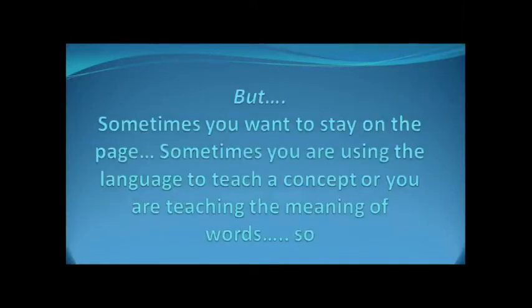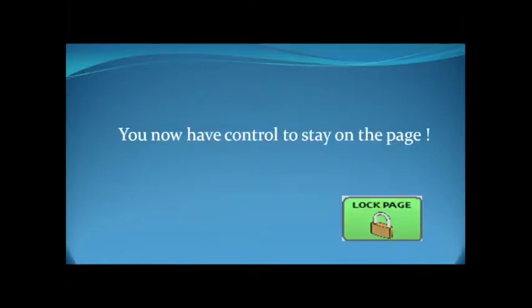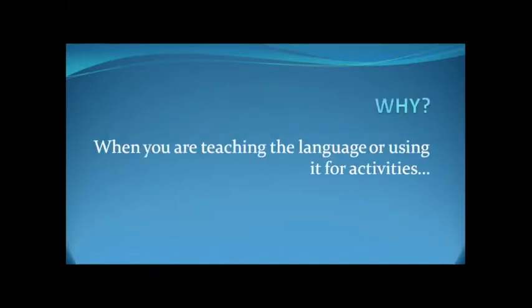But sometimes you want to stay on that page. You want to use that language to teach a concept, or you're teaching the meaning of words. So now you have control to stay on the page with a lock page button. So think about why you would be using that, when you're teaching the language or using it for activities.